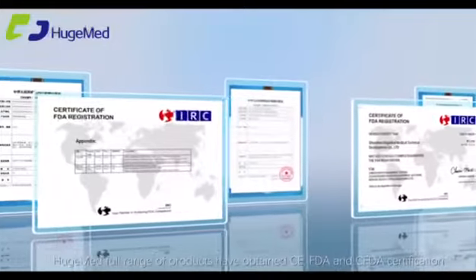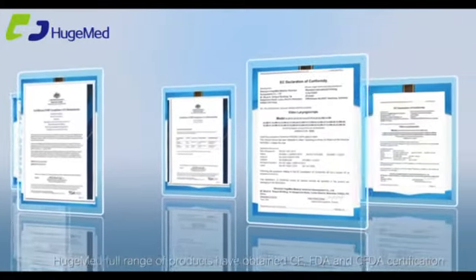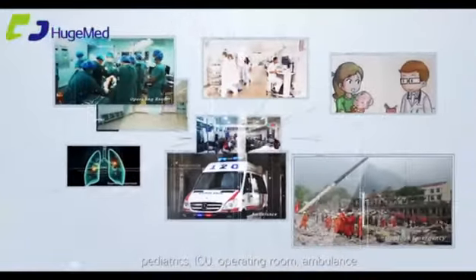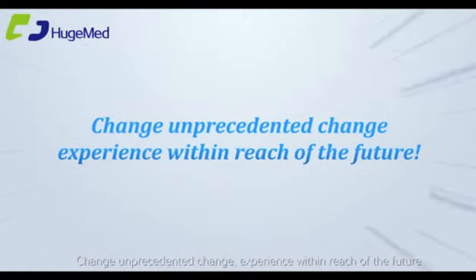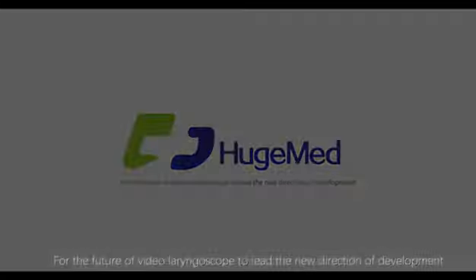The full range of products has obtained CE, FDA, and CFDA certification, and is widely used in emergency departments, anesthesia departments, pediatrics, ICU, operating rooms, ambulances, outdoor emergency settings, and many other scenarios. Hugemed — for the future of video laryngoscopy, leading the new direction of development.